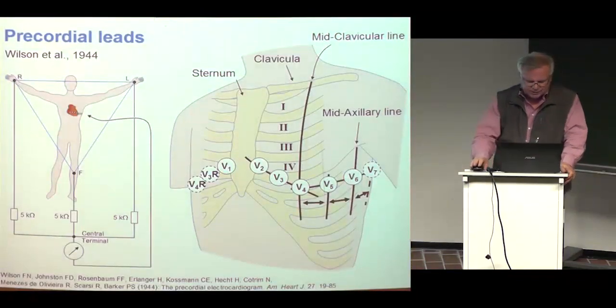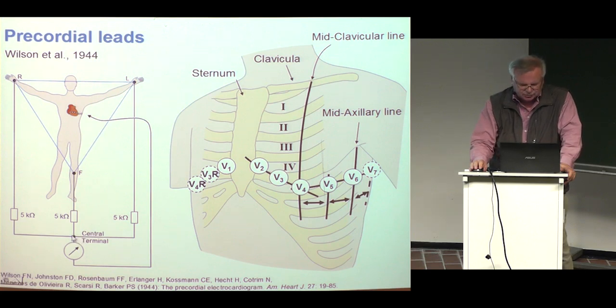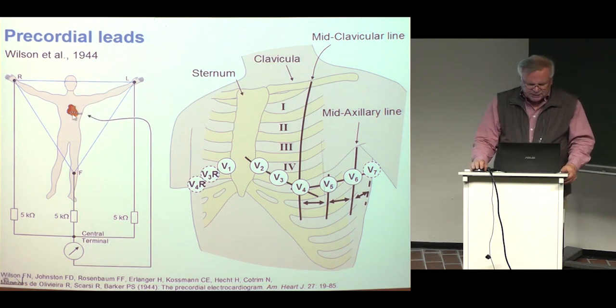Then precordial leads. This is the original reason for Wilson to use the central terminal. Now the central terminal is drawn in this way, so you more easily find that it is really not touching the skin. It is just a connection of these three 5 kilo ohm resistances, and having it as a reference point, recording points from the surface of the chest, was the original idea of Wilson, to get three-dimensional recording.